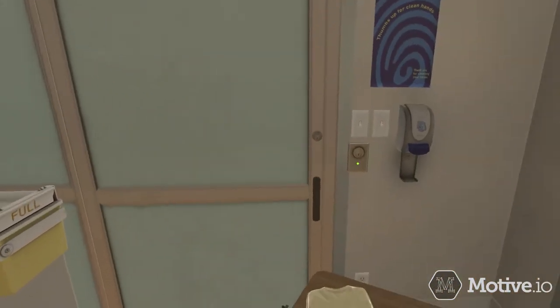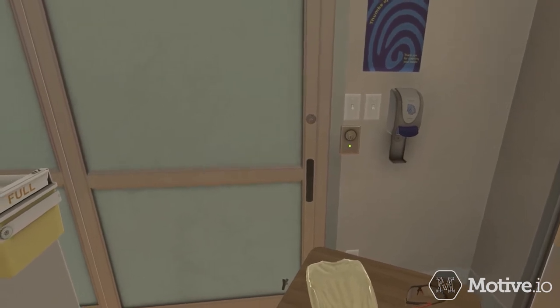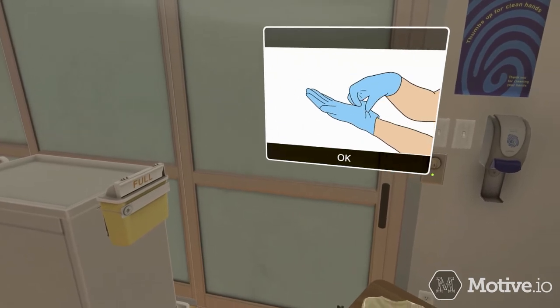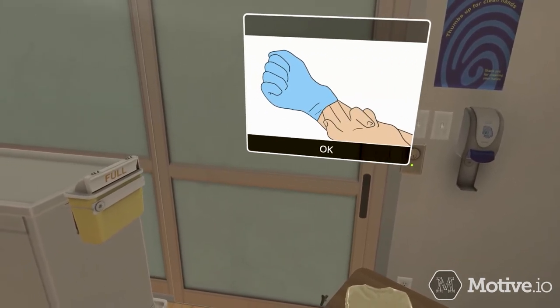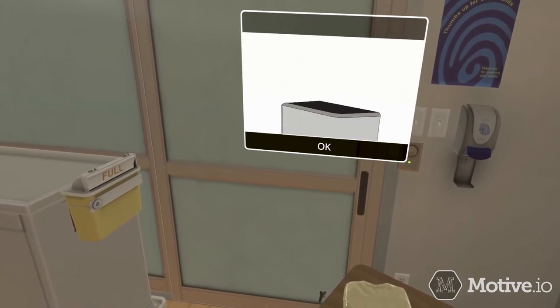Begin by removing the gloves. Grasp the outside edge near your wrist and peel it away, rolling the glove inside out. Reach under the glove on your other hand, peel it away turning it inside out, and discard.